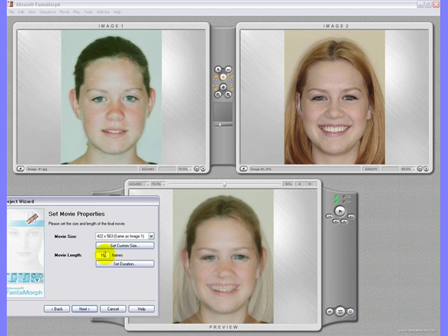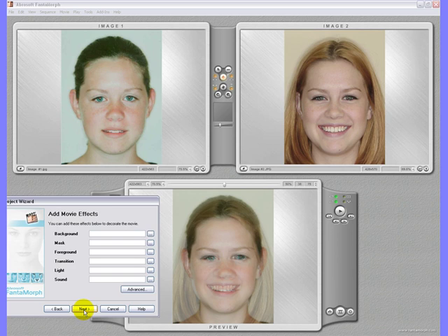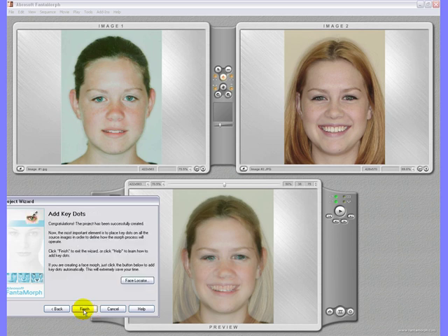Change the movie length to 75 frames. Skip the effects. Now click on face locator.